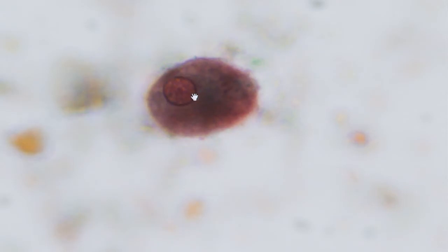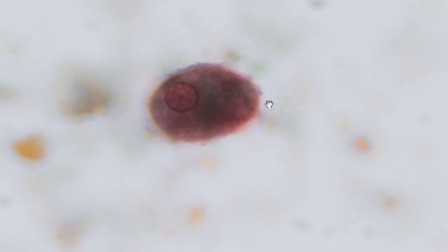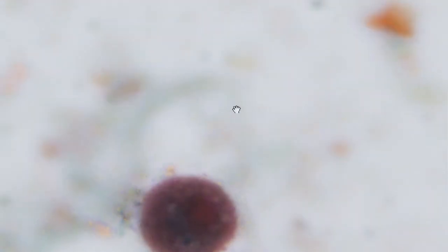Very big nucleus. It's really relatively even peripheral chromatin, but there are areas where it's a bit polar. So it's somewhere in between a histolytica and a coli, and I always think of the nuclear morphology as being somewhere in between a histolytica and a coli, but bigger. And a central karyosome, but quite a large, diffuse central karyosome. Ingested bacteria, seen here in the trophozoites.